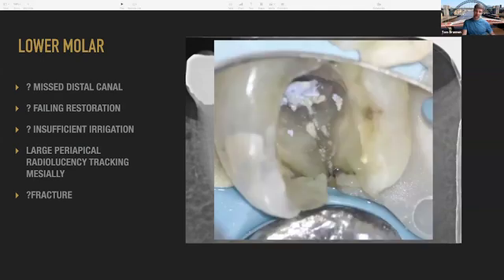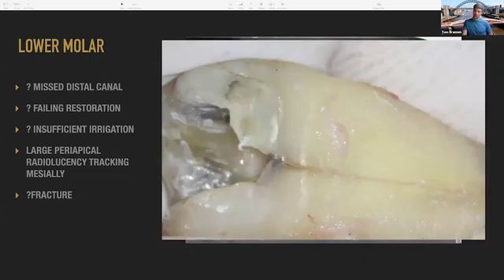And so, again, when it's that wide, there's nothing you can do really. There's no false hope there. This tooth needs to be taken out. And then we actually took it out for the lady at that same appointment, because she didn't want to consider implants for the 7. And you can really sort of see the full extent of how far that crack goes now. It's certainly going down as far as the middle third, down towards the apical third. It's quite a significant crack.